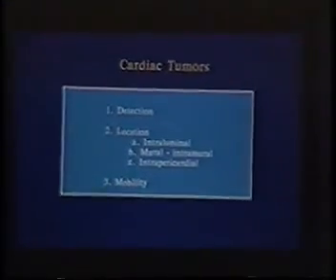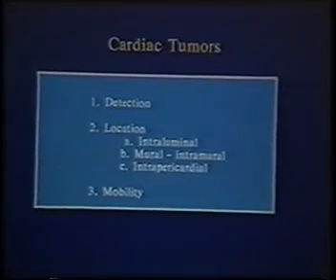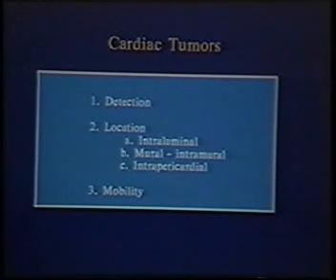In summary, in terms of cardiac tumors, number one, MR is not going to replace echocardiography. Echocardiography is too easy to do, it's portable, and it's not as expensive. On the other hand, a great number of our patients now come from the echocardiographers because in the past, when they saw things they didn't understand, now we can work it out for them. In many cases, they can miss tumors, and often they pick up normal anatomic structures that are misinterpreted as tumors.